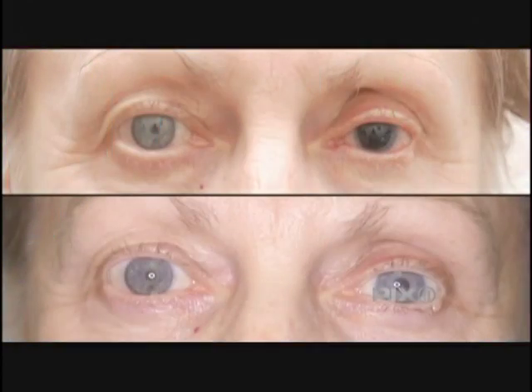So there are real medical procedures where people might have an abnormality with their iris, or they're born with a problem with their iris? Exactly. So we've concentrated on patients who have congenital aniridia, which is a patient who's born without the iris, patients who've had injuries, patients who have had injuries related to complications of cataract surgery, for example.